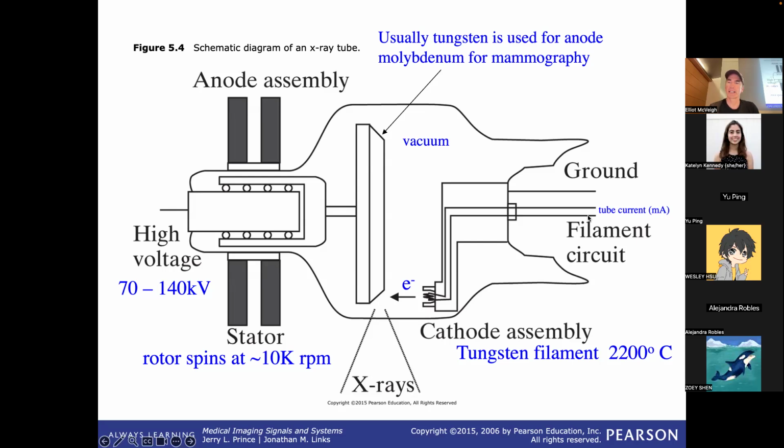Okay, I think that's it. We can change the amount of tube current across this cathode. And remember when I said that the high resolution picture had 300 mA and the lower one had 50 mA, that's the current going through here. So that just means more or fewer electrons go through, right? So if I double the tube current, the number of photons coming out doubles.